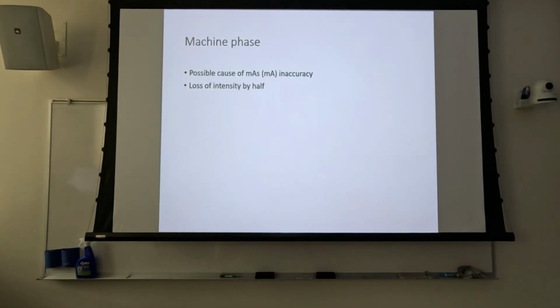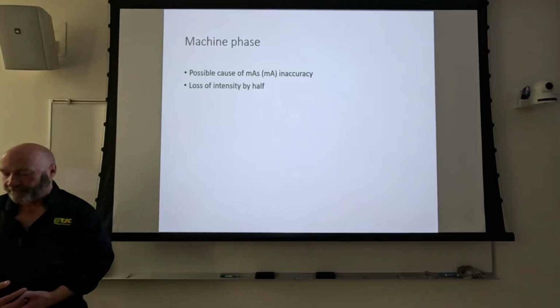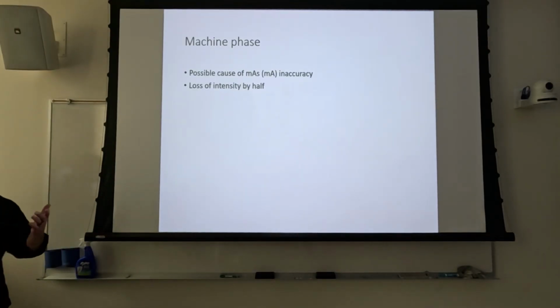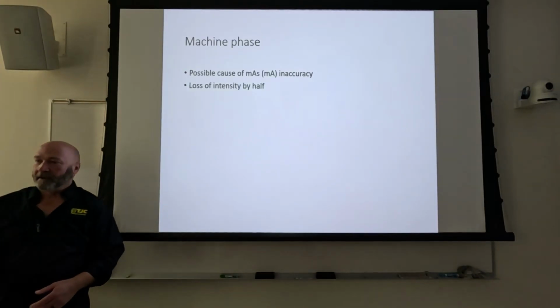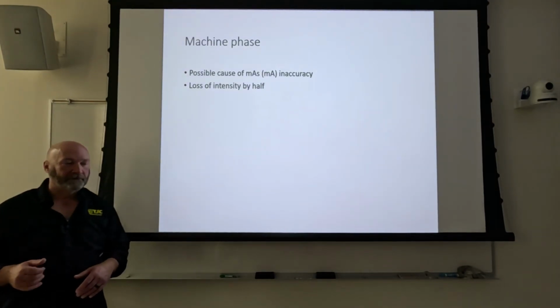Okay, so we already talked about one of these, but the other one is, what if you walk into the patient's room, and we hadn't talked about this, I think, since first semester physics. Let's say you walk into a room with a specific patient. It's your last patient of the day. You made an exposure, you phototimed, you made an exposure on the patient. Let's say you didn't phototime. I'll get to phototiming in a second.